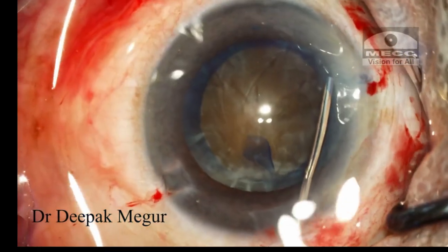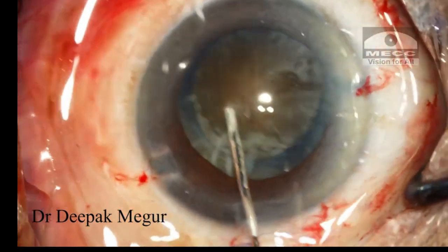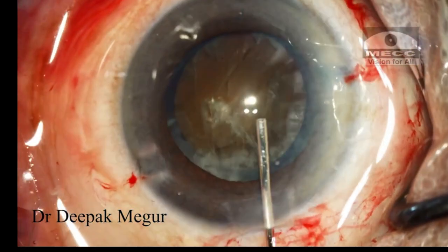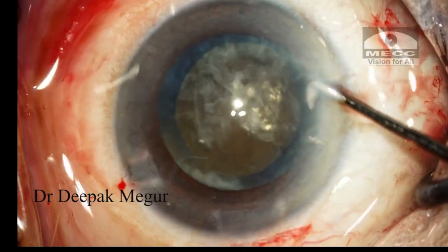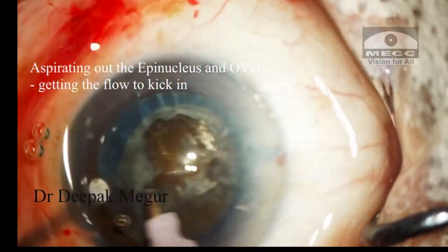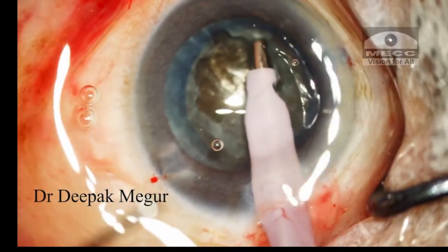Once the rhexis is done, hydrodissection is performed with the bare minimum amount of fluid, followed by decompression to let out the trapped fluid. The nucleus is gently rotated to ensure that there are no corticocapsular adhesions. My strategy for nucleus management is to do a direct chop for this case.